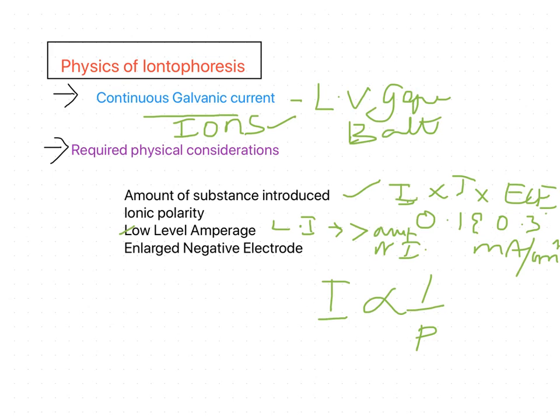Lower the intensity, higher the penetration. So the physics involved with iontophoresis necessitates low milliamperage and low percentage of ion sources.